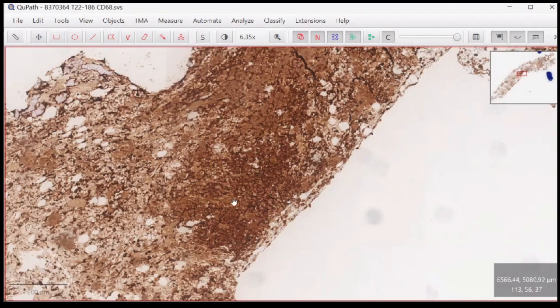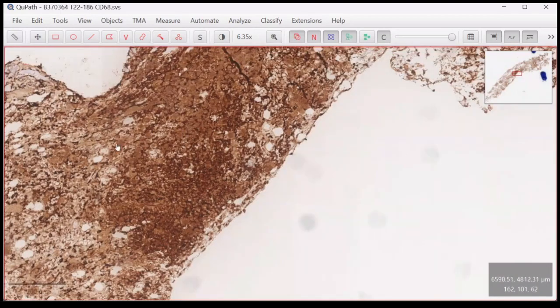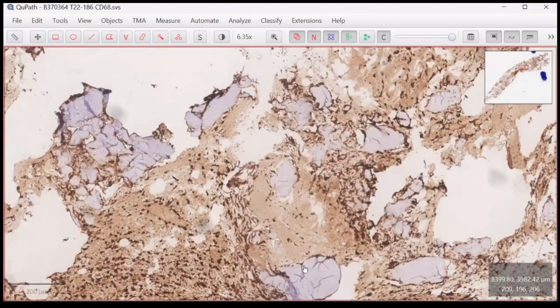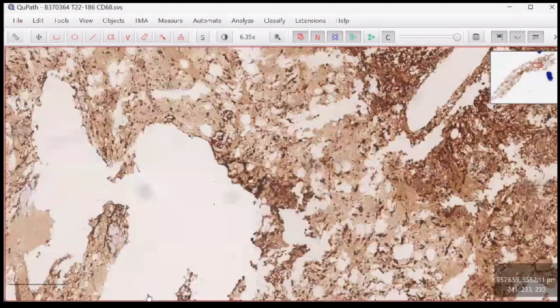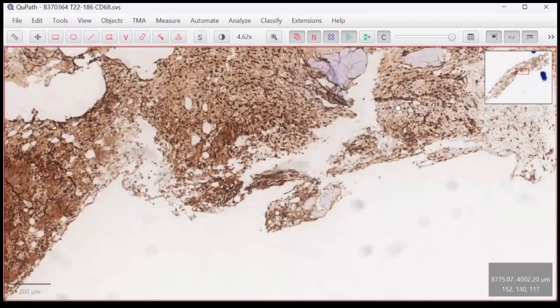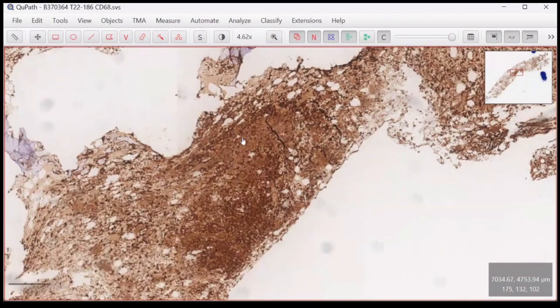If not, then you have to compare this hypercellular area of CD68 positivity with CD99, and remember that in the hypercellular area we saw erythroid colonies and also megakaryocytes, isn't it? So when checking CD99, the mapping must be on this area. This area.